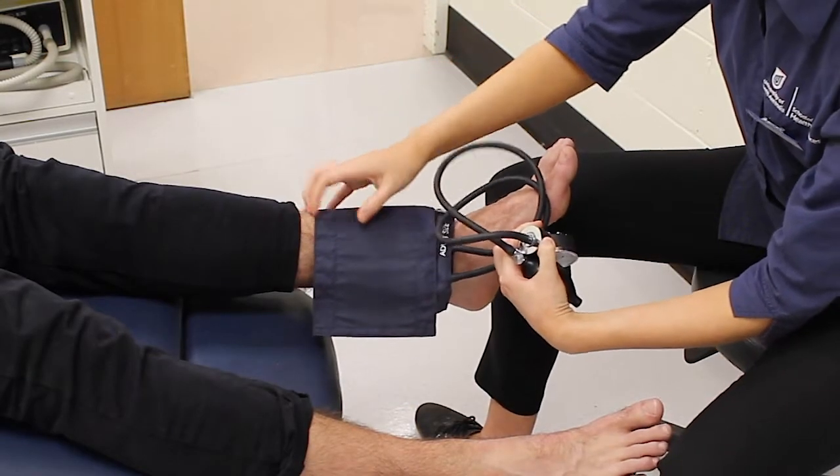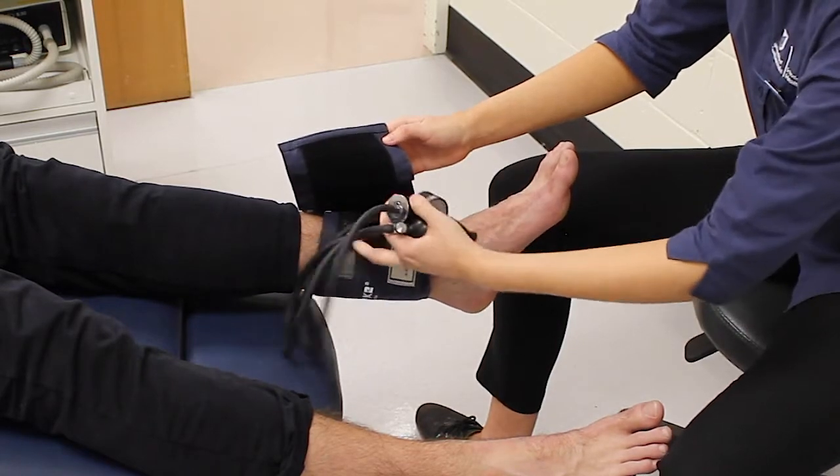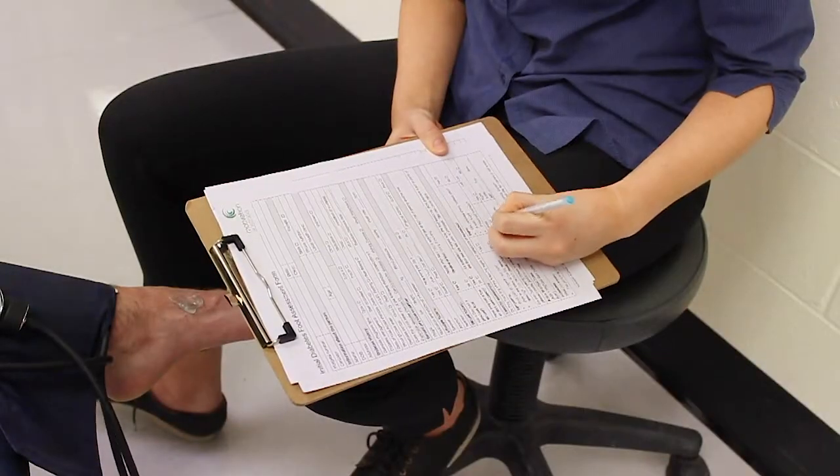Ensure the cuff is completely deflated and remove it from the person's foot. Using gauze or a paper towel, wipe away any gel from the person's foot. Record the findings.